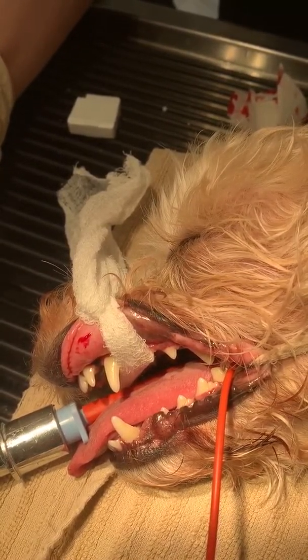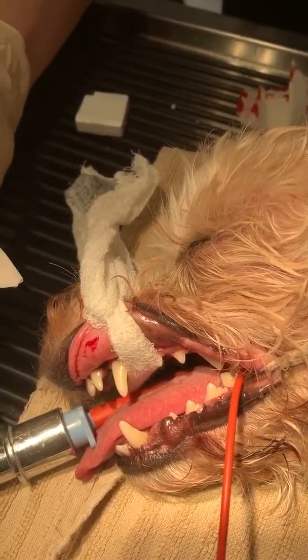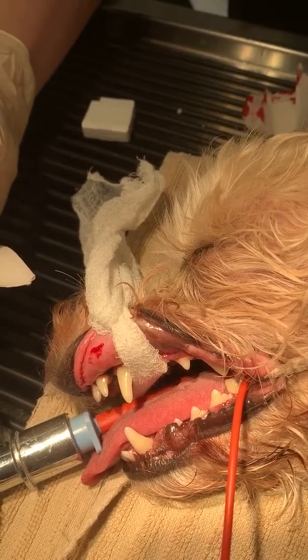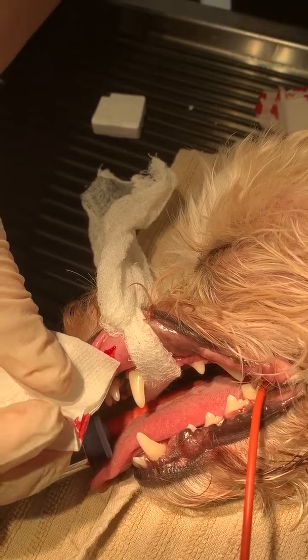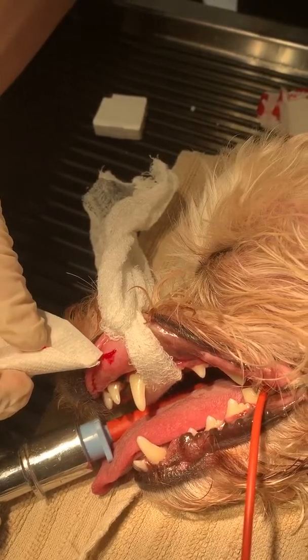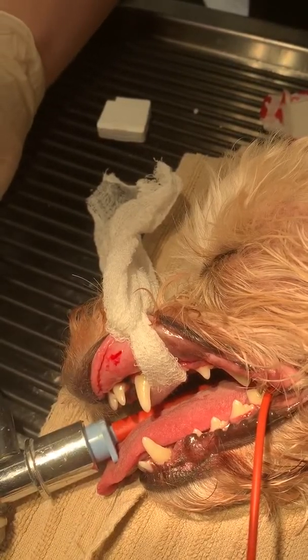About here is where it's really basically almost not bleeding anymore — you can kind of see it's clotting. We're about two and a half minutes into it now — I misstated that earlier. So this dog would be fine; all those platelet functions seem to be doing well. After it stops, I might dab it just until it's not bleeding anymore, and then that would be how it's done.